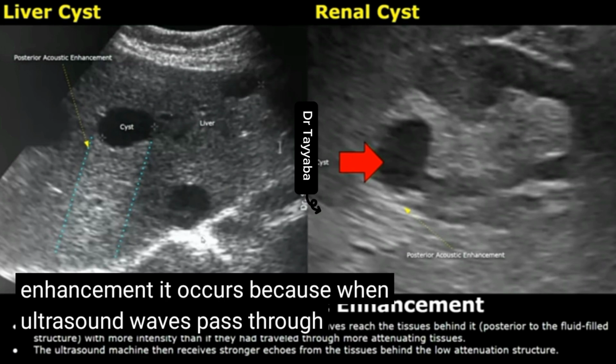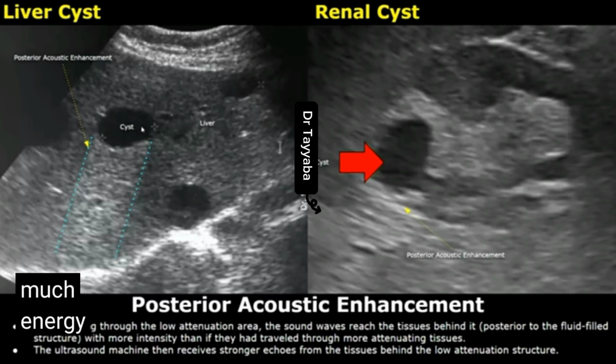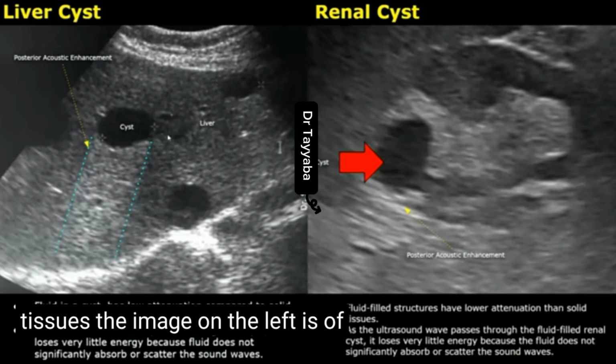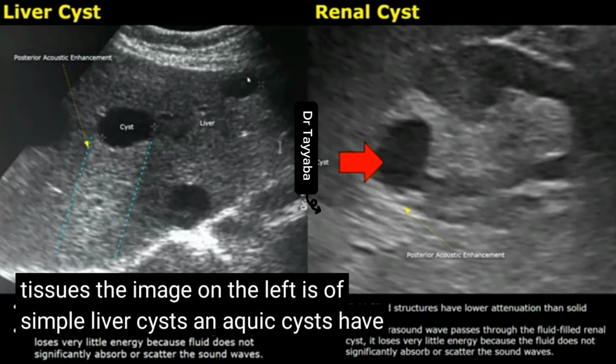It occurs because when ultrasound waves pass through the anechoic fluid-filled structure, they don't lose much energy as compared to when they pass through nearby solid structures. The image on the left is of a simple liver cyst.